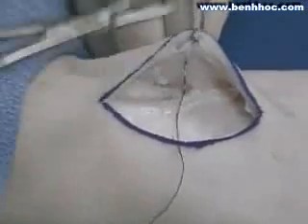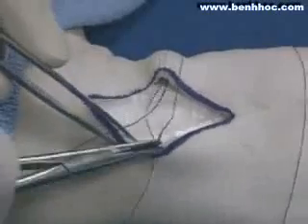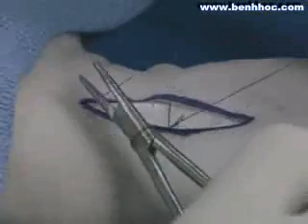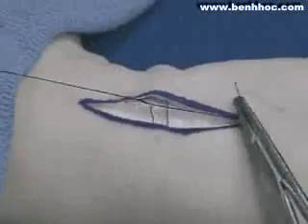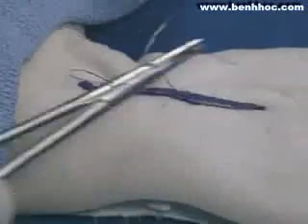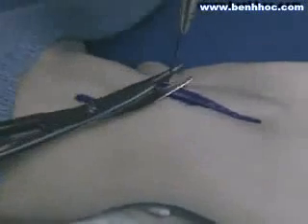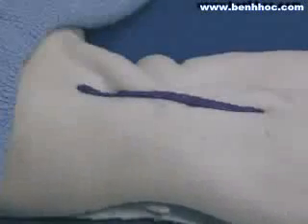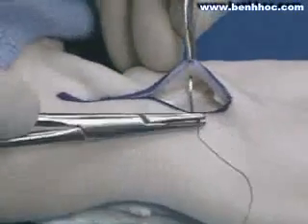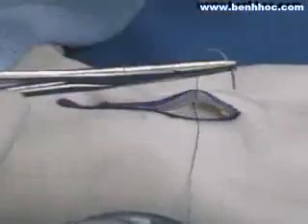The first suture that is placed is a deep suture, and it is buried. It is placed in the dermis at approximately the mid portion of the incision, according to the principles of halving. A surgeon's knot is used to close the deep tissues, thereby approximating the wound edges. Notice how the wound edges come together. The deep suture is cut on the knot, and the wound edges are now well approximated. A second deep suture is placed according to the principles of halving.